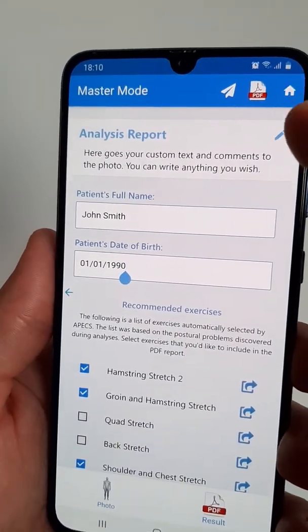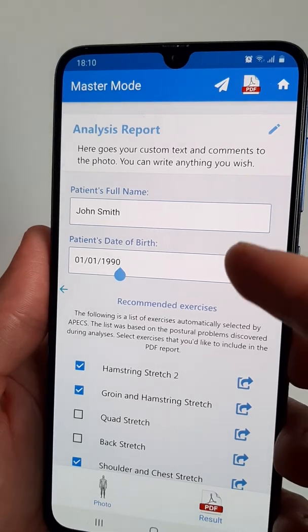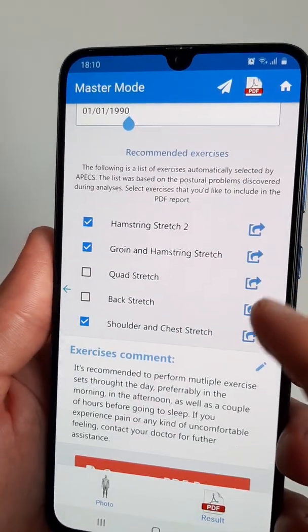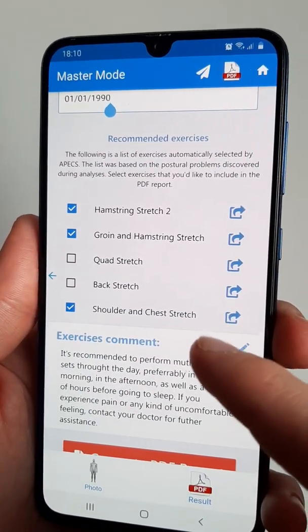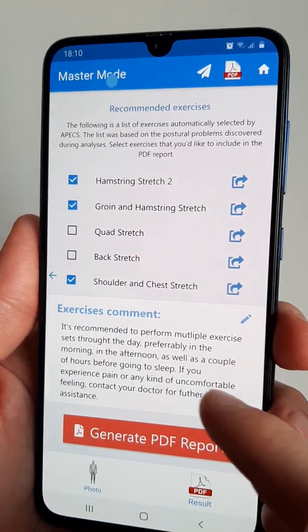In here, you can add your own commentaries, add your client's name, date of birth, and select some specific exercises to integrate in the final PDF report and add a note to them.